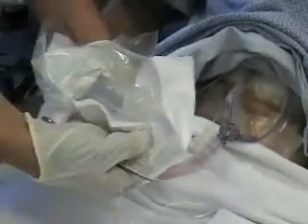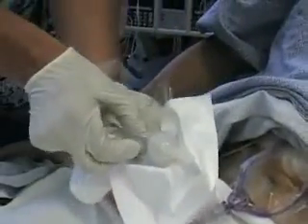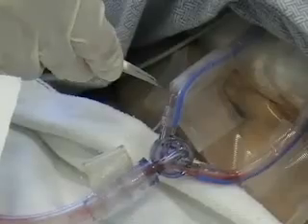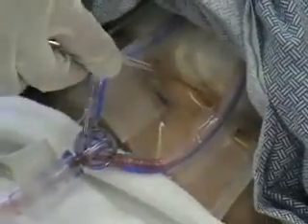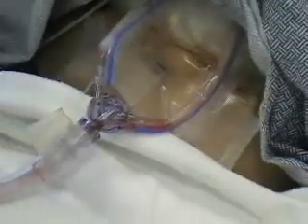So what I'm going to do is I'm going to undo this, push all the air out, I'm going to clamp it, create a vacuum — and then we have a vacuum because I'm squeezing it. And then I'm going to connect this here simply on to where it connects, where the tape is. The tape is holding the tubes to the patient's abdomen as an extra security, but that's what we're going to do here.